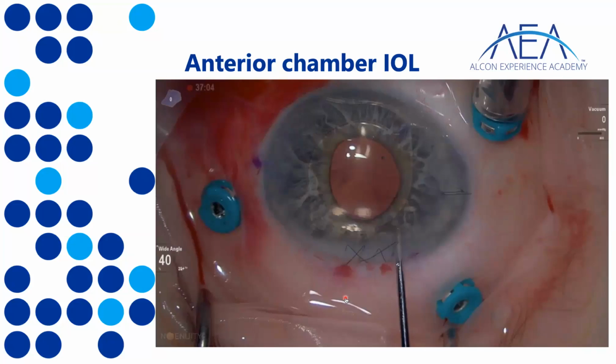So instead of going corneal and creating a big 5.5-6 millimeter wound, which will create some astigmatism at some point, despite how good you are at stitching the cornea, what can be done is to create a frown, a cut like this, definitely bigger than the one you create in the cornea, but in the sclera. From here, create a channel up to the limbus, and then go inside with the blade.